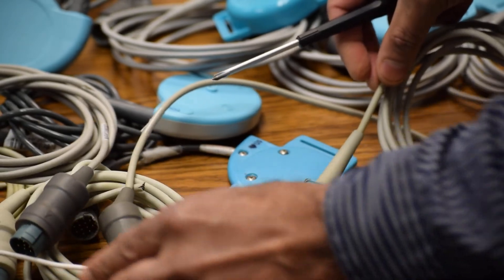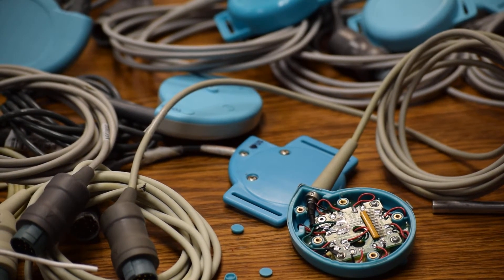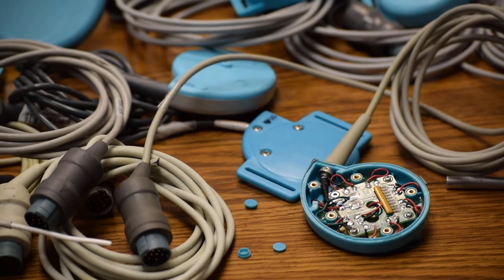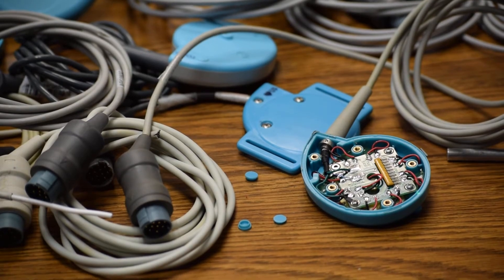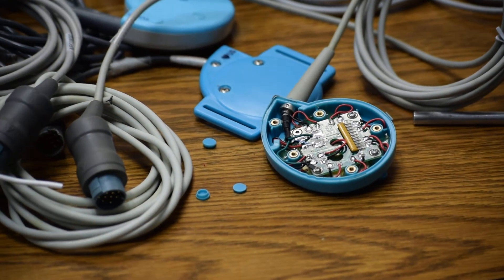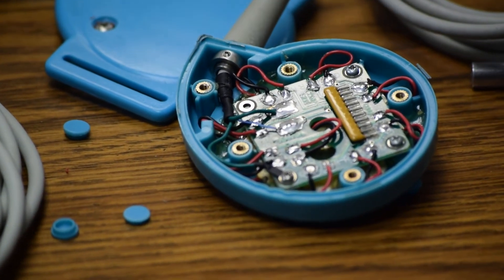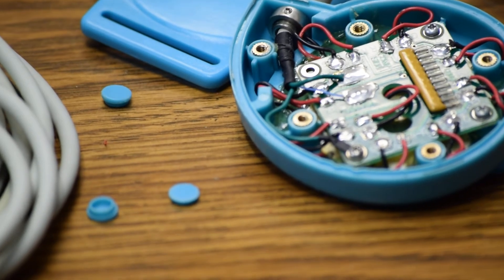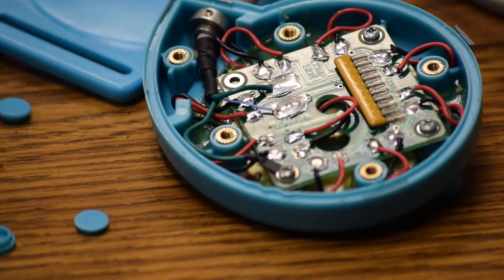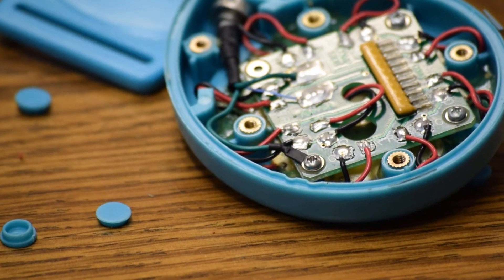You can see inside this transducer — there is a glue poured as if a syrup is poured into a dish. The glue goes right from the front surface to the top surface, completely damping the crystals. This is non-conformal work, and that is why there is an intermittent spurious signal pickup problem. Central frequency changes because of this kind of workmanship.